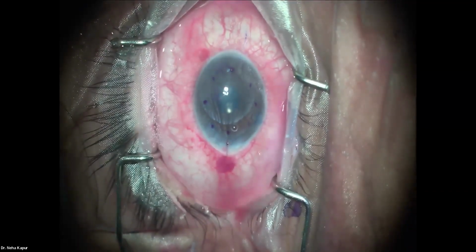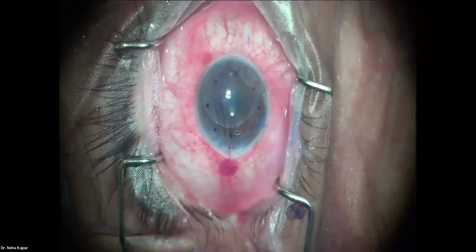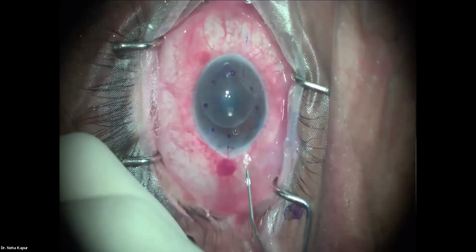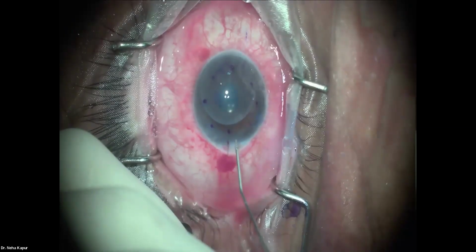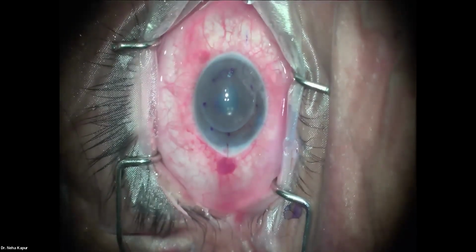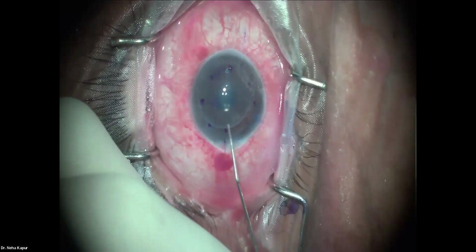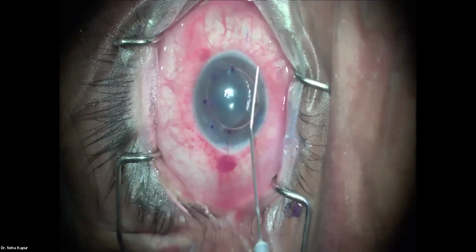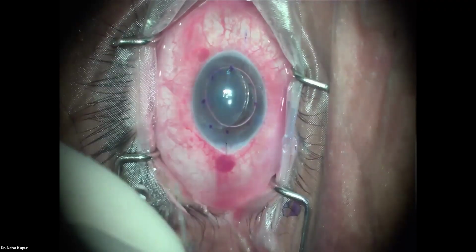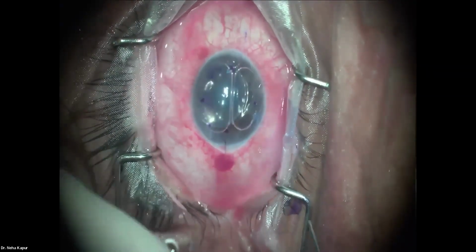Air, hydro. Air ready. Form the chamber with fluid first. And this is where you want the air, under the lenticule. But like I said, we need the chamber to be tight for the lenticule to move.